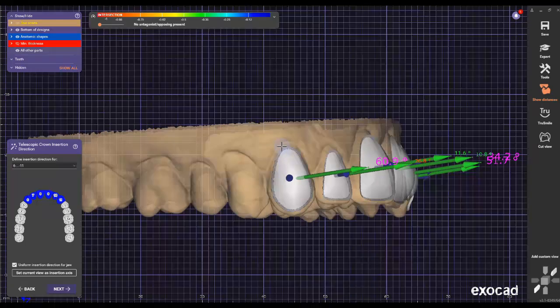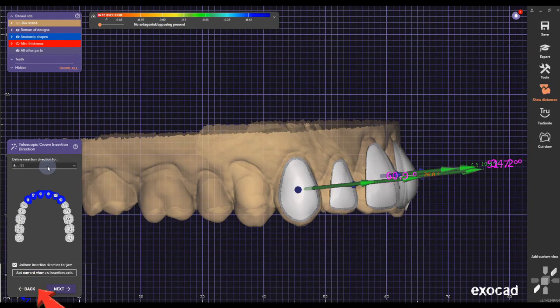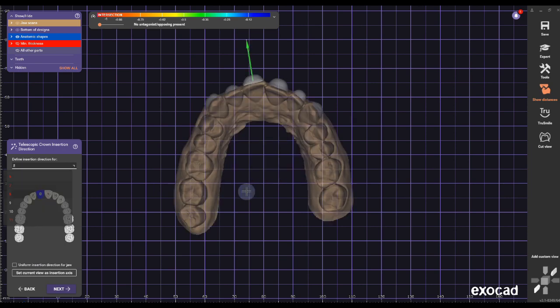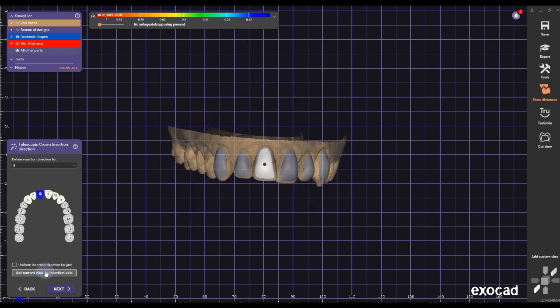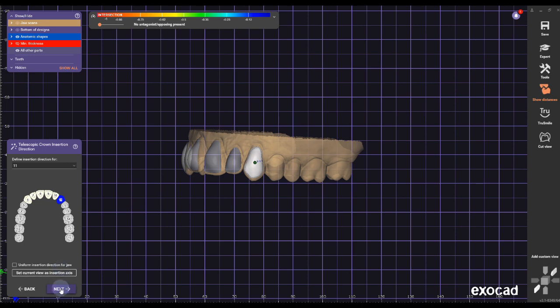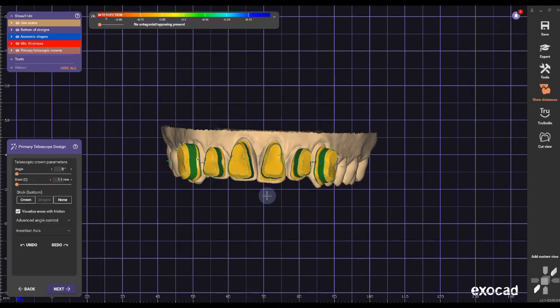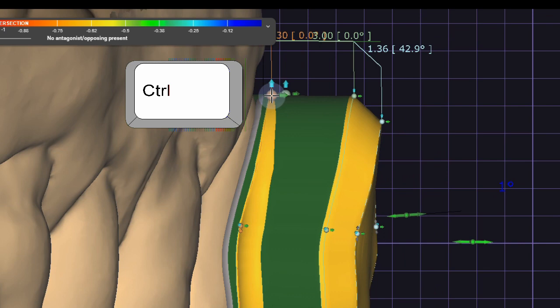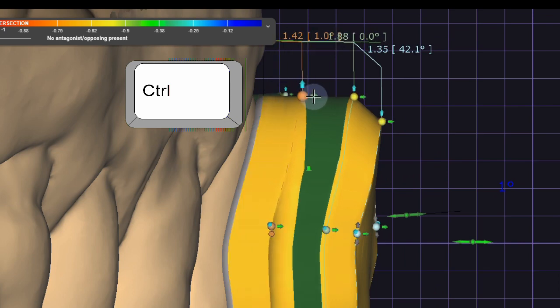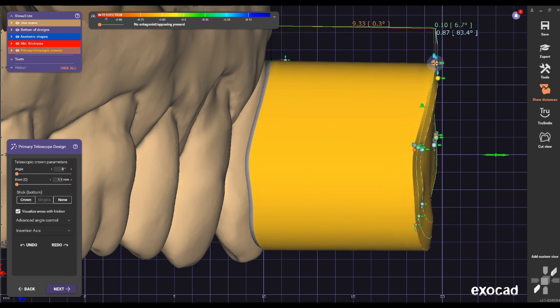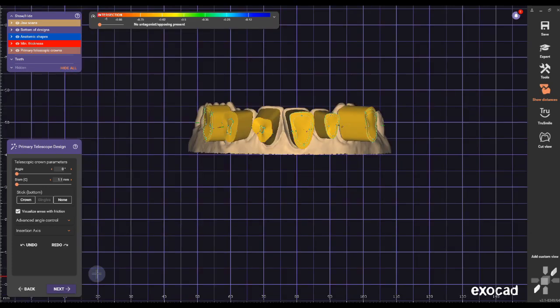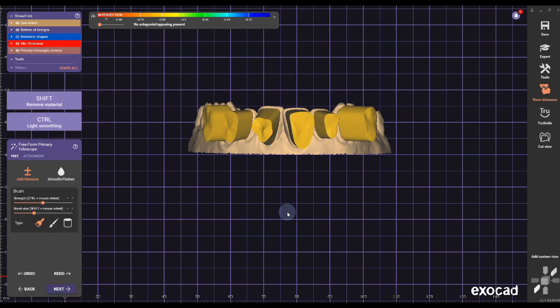In the telescopic coping part, make sure you uncheck 'Uniform Insertion Direction' because telescopic copings usually have a uniform direction but in this case we don't need that. We need the individual ones so the insertion direction matches the margins. Then hold Control, click the little tiny sphere, and drag it out while holding Control. Do this for each tooth — sometimes they'll morph a little so carefully straighten them out.